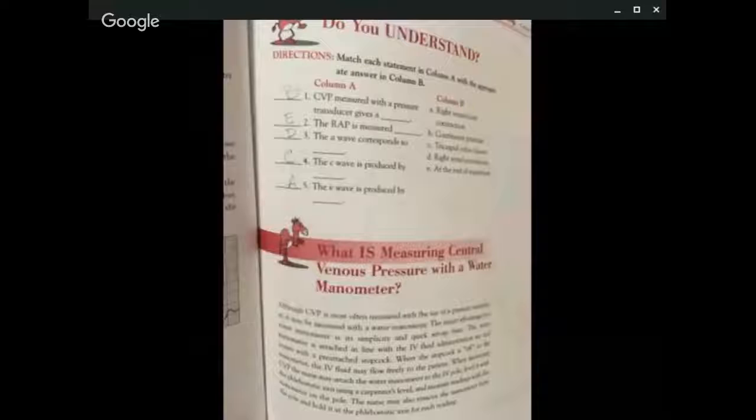Measured with a pressure transducer, continuous printout. The right atrial pressure is measured at the end of expiration.